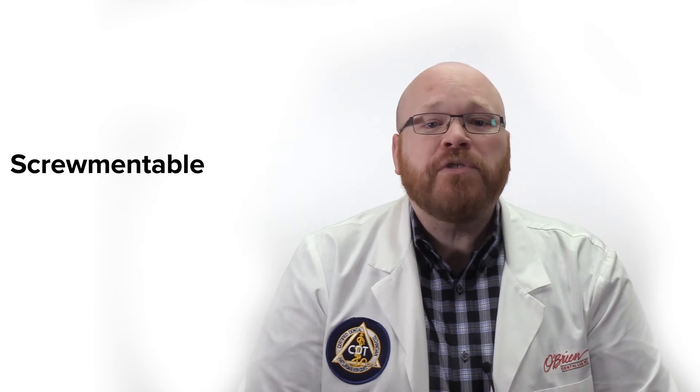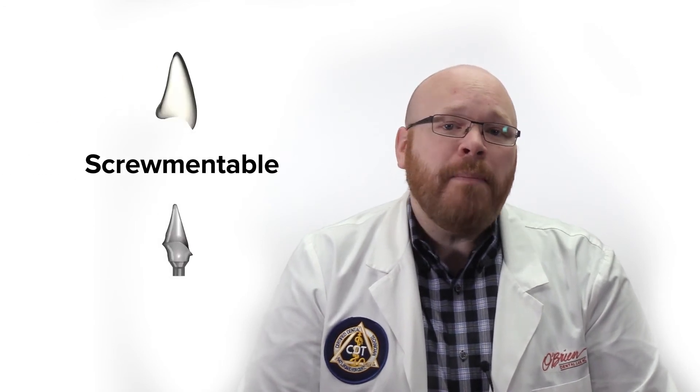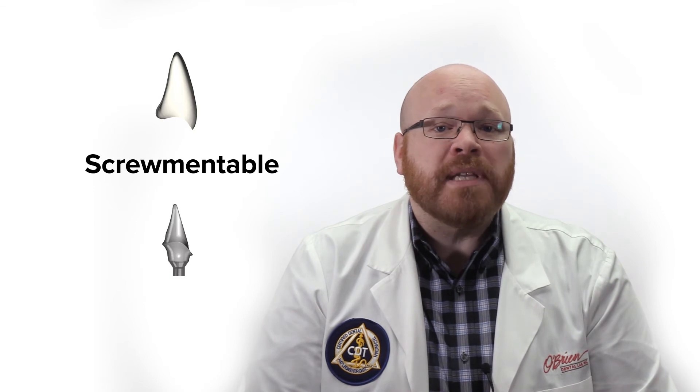The style of the crowns made with these abutments are often referred to as screwmentable, meaning that the abutment and crown are each fabricated separately, but the crown is made with an access hole in it so that they can be cemented together to create a screw retained crown. One important aspect to note is that unlike traditional abutments, the screwdriver channel is actually smaller than the screw head, so the screw will not be able to pass through the crown once it's been cemented to the abutment.